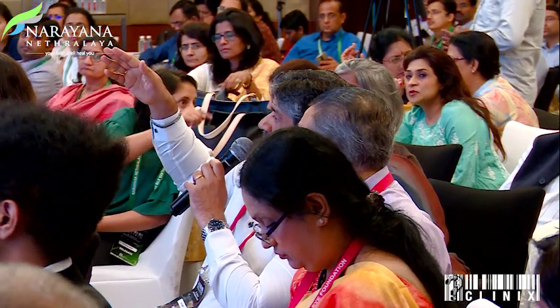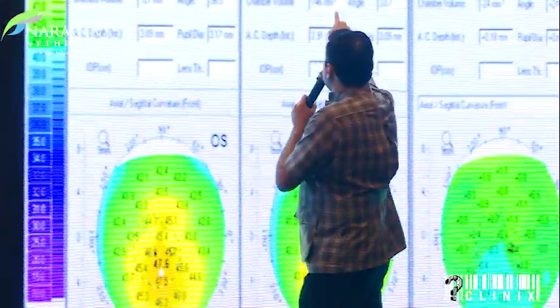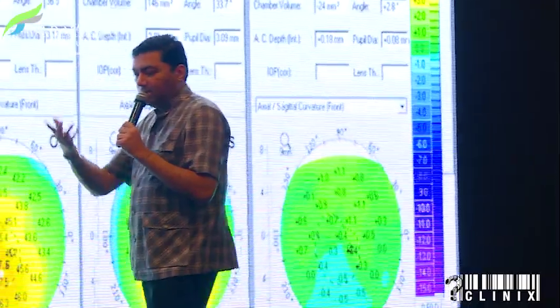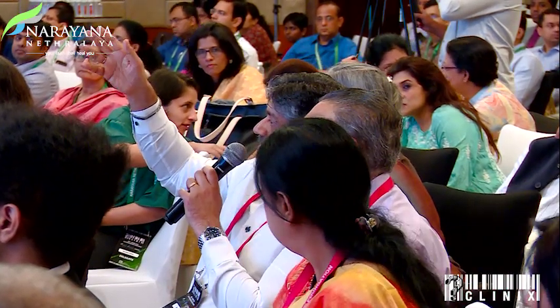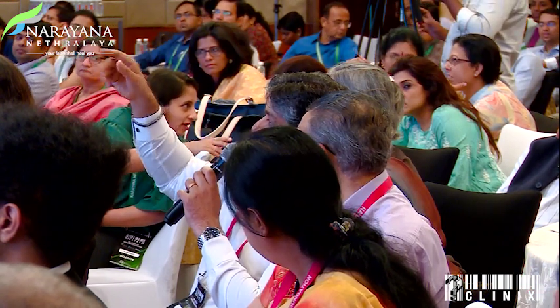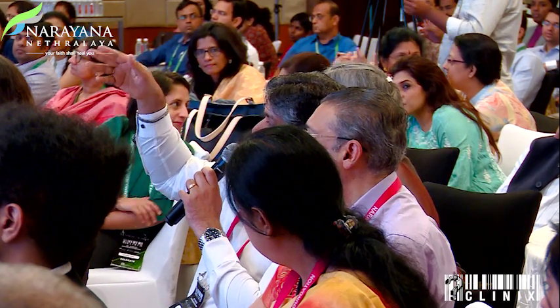But the pupil is not a good landmark. It's probably better to take something like the limbus. No, pupil... this is the thinnest point. It's giving you the X and Y for the Pachy, yeah, but the pupil can be dynamic, it can change. So then there's a centroid shift. So basically, you cannot exactly estimate. At different times, with different pupil sizes, the centration can be different. So it's better to use some fixed landmark like the limbus, probably, to know if your scans are centered well.